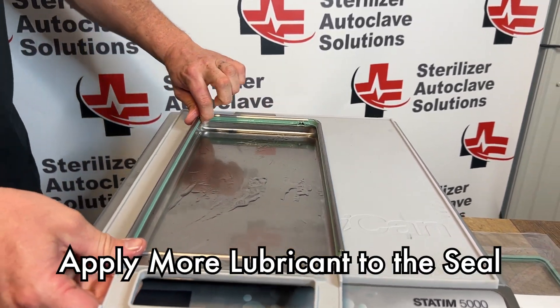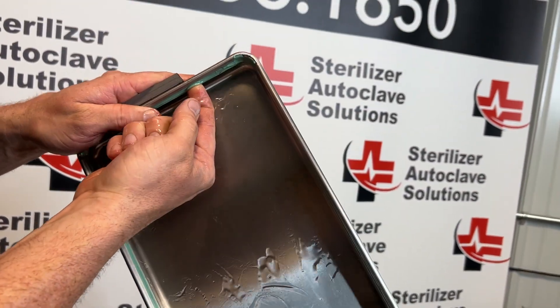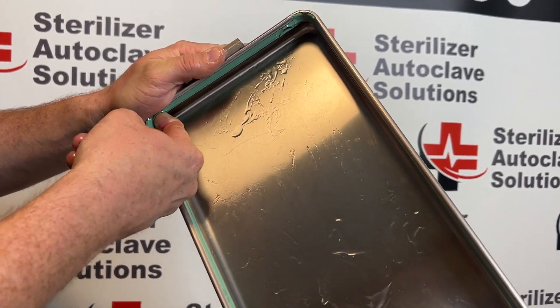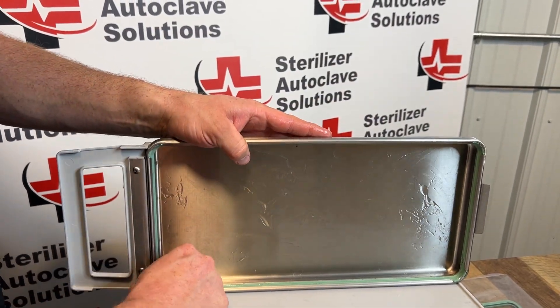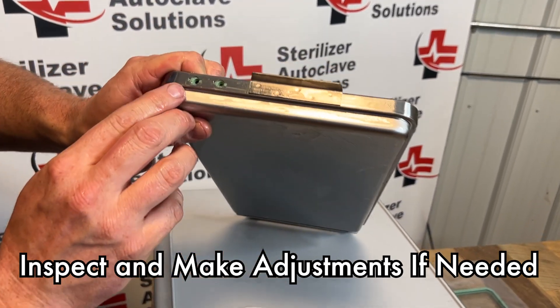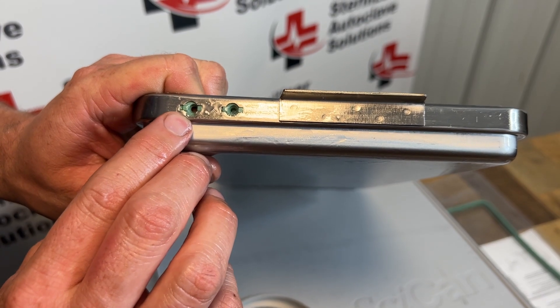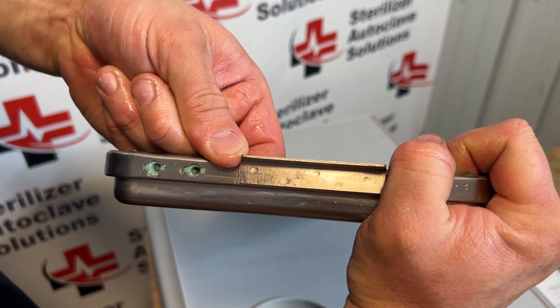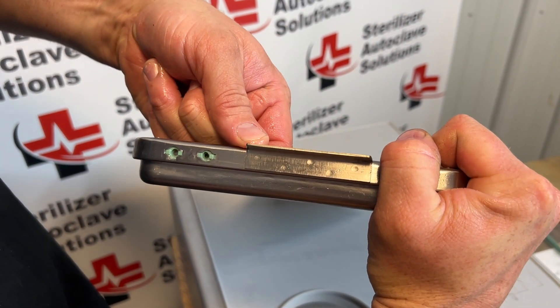Once that is all the way in, we're going to re-lubricate one of our fingers and put it right between the grooves of that seal, pressing in and up. I'm going to run my finger all the way around the seal and you will feel it set into place. We want to inspect and make sure the square blocks are directly in the center. I'm going to slide this over by putting my finger back in that groove, pressing in and pushing in the direction I want it to go.